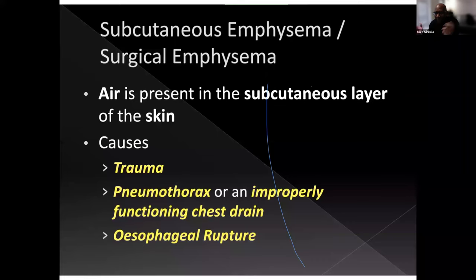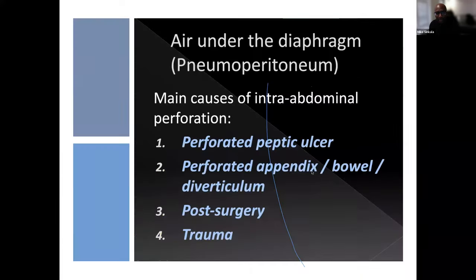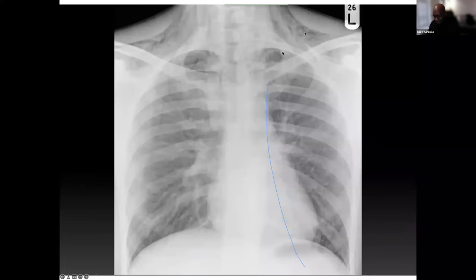And then they have chest pain. When they do a chest x-ray, you would see that possibly there is abnormal presence of air in the mediastinum, a pneumomediastinum, yes. And then you would see subcutaneous emphysema. So on a chest x-ray, I would be worried about a ruptured esophagus in this case. This could be caused by so many factors like I've mentioned.